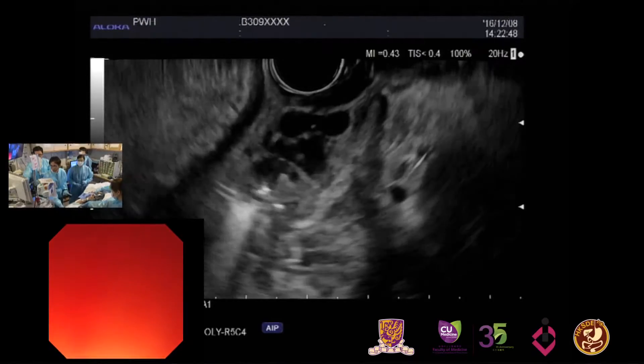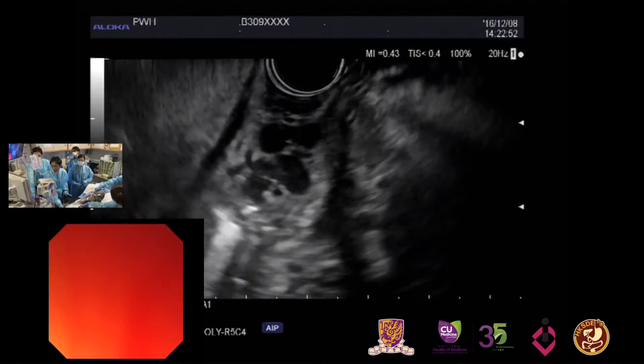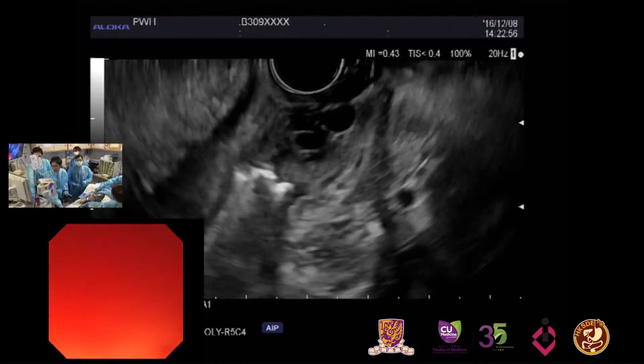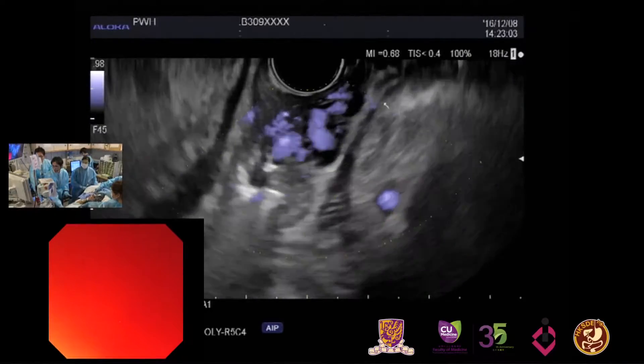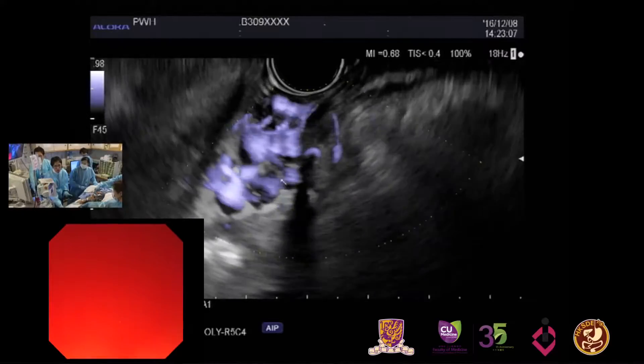My scope is just below the OG junction, and we see these snake-like tubular structures that are suggestive of gastric varices. Can we put it on top of it? Indeed, we see gastric varices here. I think they have become more prominent after resuscitation.